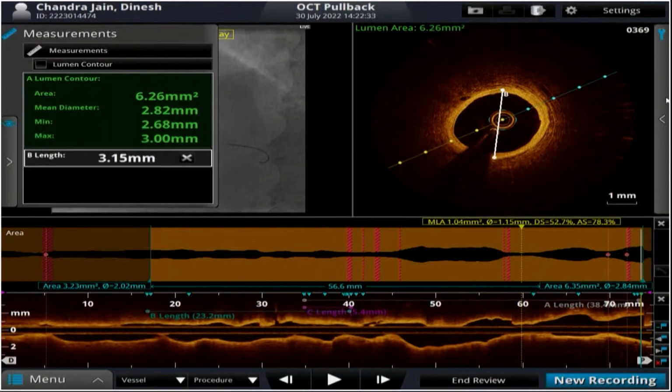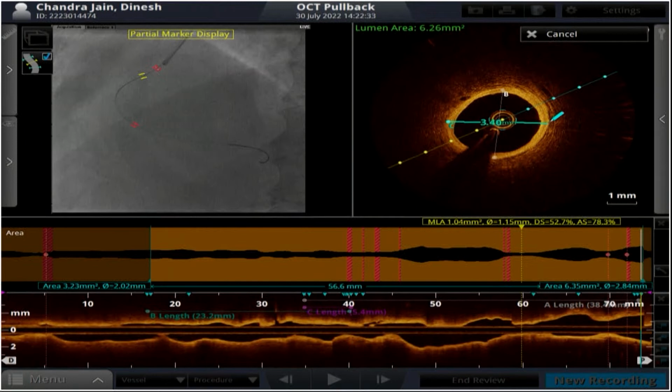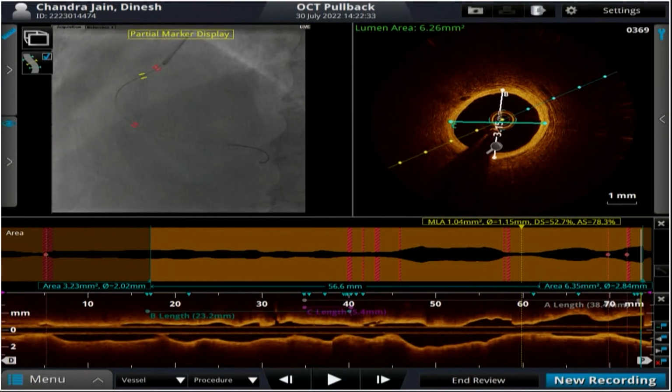Yeah, very nice approach to 3.1 and 3.2 to get perfect information, right? So probably you have to go with 3.0 and then post-dilate with 3.5. Maybe 3.25. So there are two approaches. One is to use a 275 and post-dilate with a 3, or use a 3 at low pressure and go up depending on what we use.